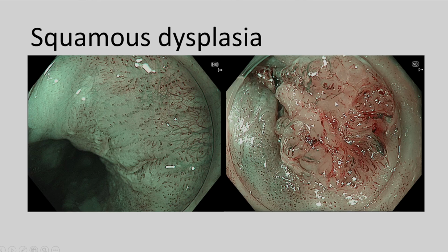This is jumping out, it's nodular, it has lost its pattern, and whenever you see the pattern, they are type 3s. It's completely elongated and broadened. So that is squamous cancer. Choose the areas. You can do ESDs for smaller areas to resect here, but this one should not be attempted.